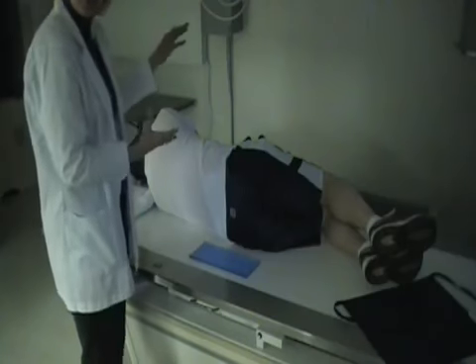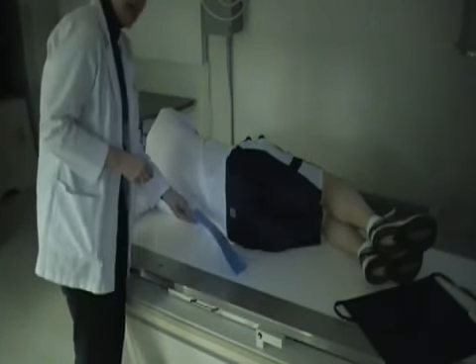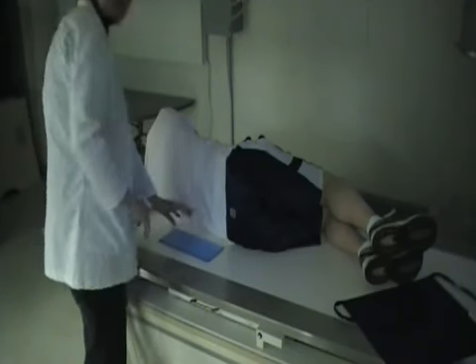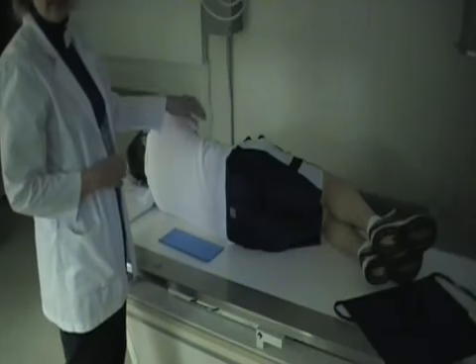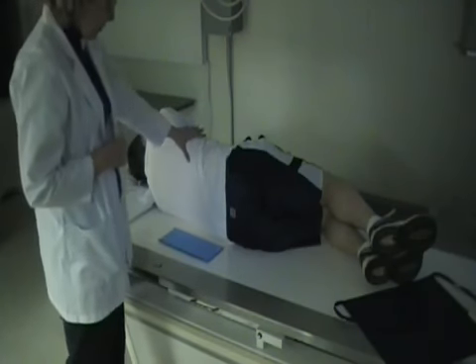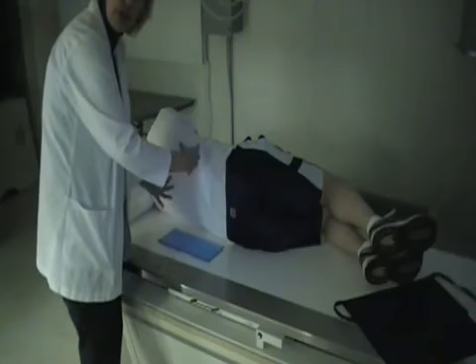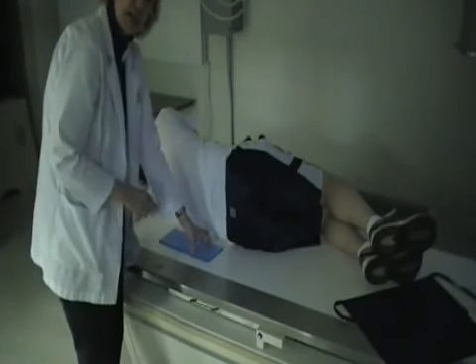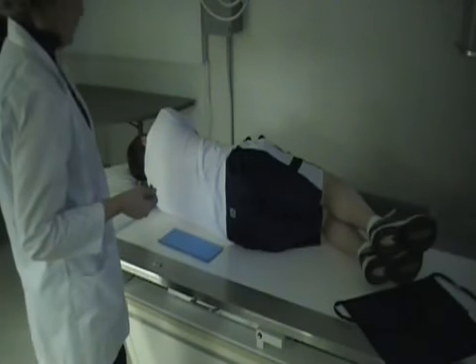On real thick patients, if you're doing a lateral lumbar spine, it would not hurt to lay this lead shielding just posterior to the back. You just have to be careful that you do not have it within that light field. But once you lay it here, whatever scatter radiation you have coming out of the patient, this is going to absorb it so that it does not reach the image receptor. Okay.